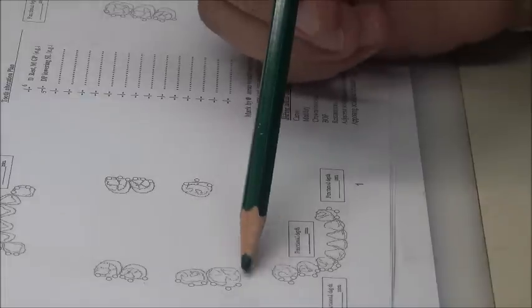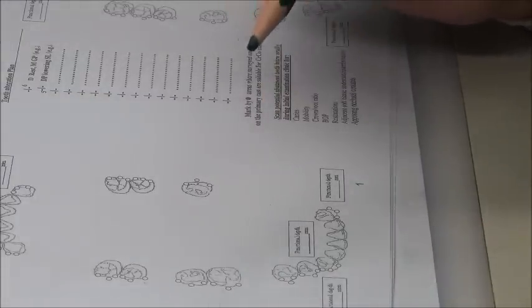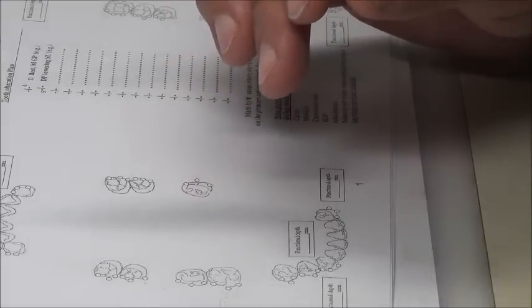So simply, for my design, Akers, and the saddle area, the best resin retention method is mesh, no. We said it in the lecture. What is the best? Open lattice. Why is it the best? Retention of what? Yes, acrylic retention.